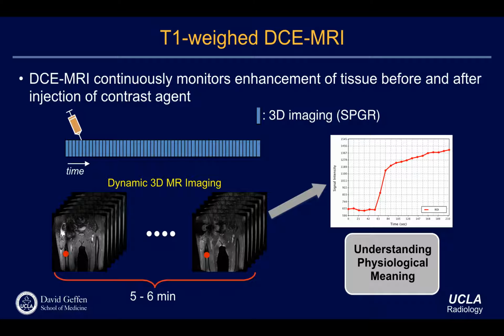So there's a first pass and the second pass going, and so on and so on. And then every time you go, you have a different kind of response. So as you watch the video and the MRI output, you see a different image with tissue changes. Yes. So again, this is the signal intensity over time at this location, correct?